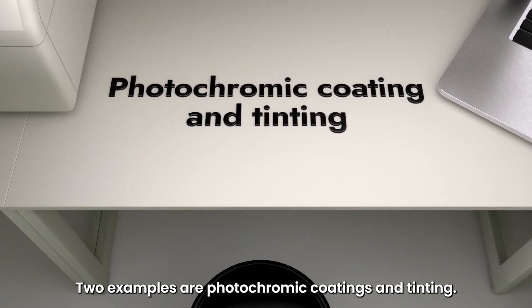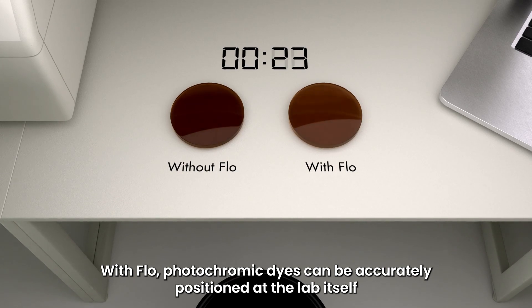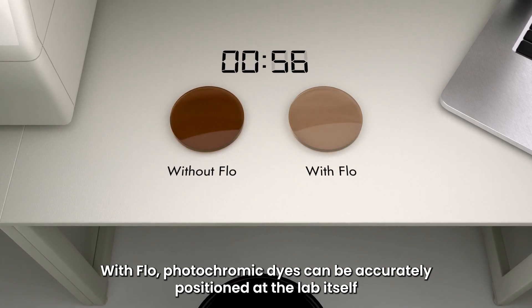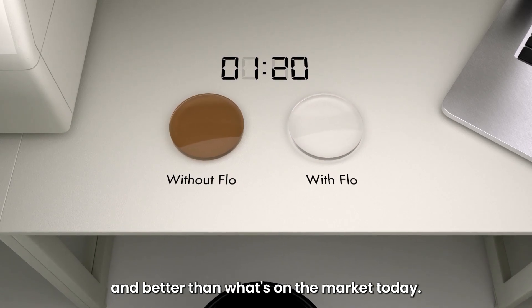Two examples are photochromic coatings and tinting. With Flow, photochromic dyes can be accurately positioned at the lab itself to create a photochromic lens that's cheaper and better than what's on the market today.